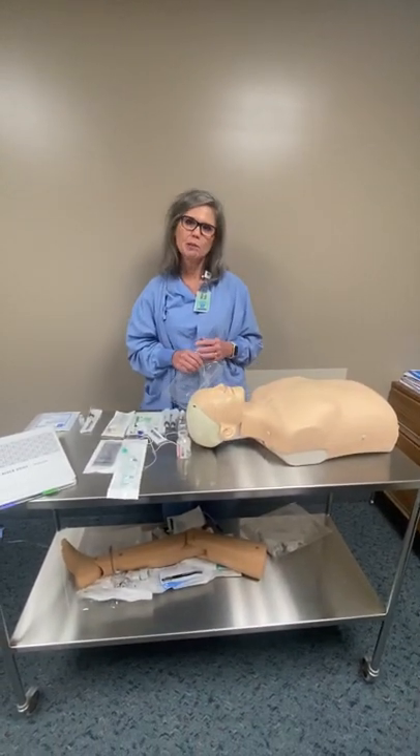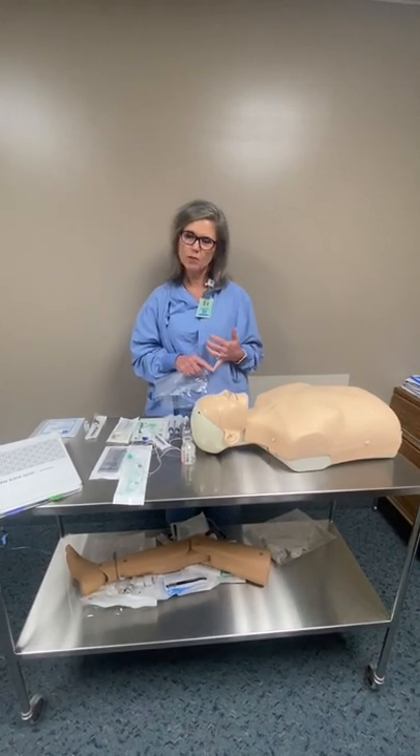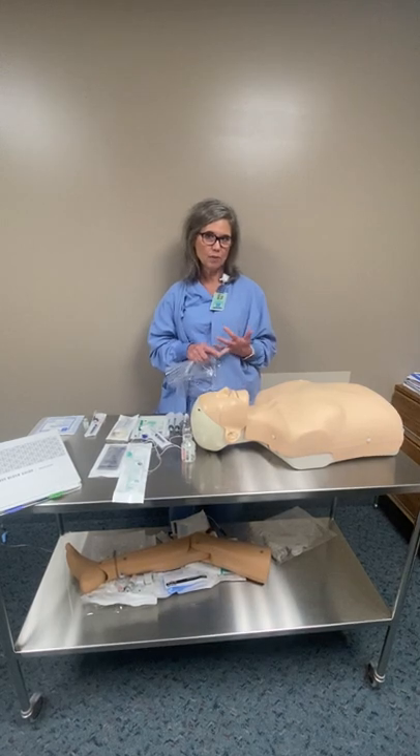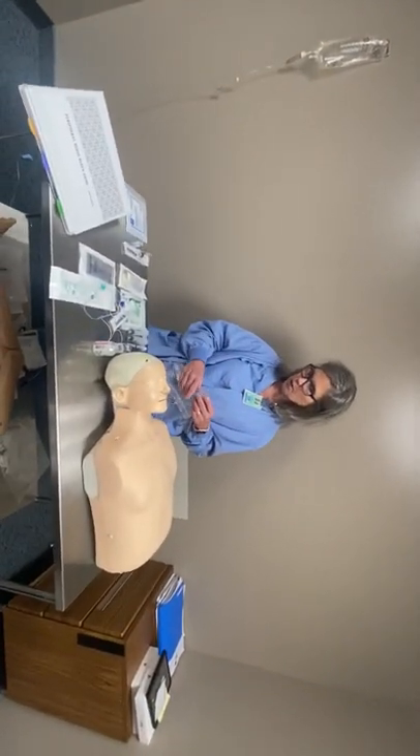Before we get ready to do a nerve block, you always want to make sure that the anesthesiologist has talked to and consented the patient for a nerve block. Even before that, you want to make sure you have an order from the surgeon to get a nerve block done. Once you have those things, go in and meet and greet your patient. Hook them up to the monitor and put some oxygen on.